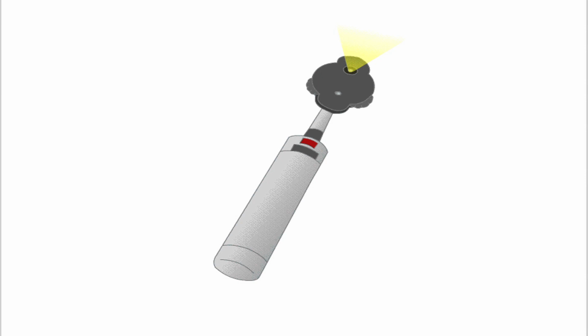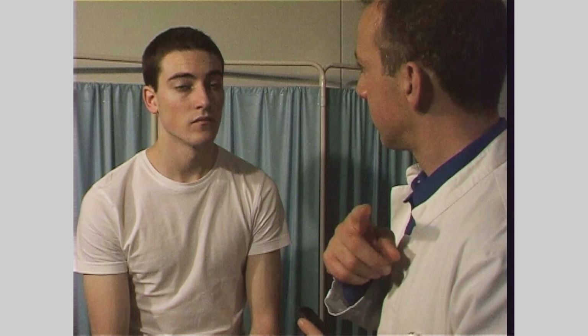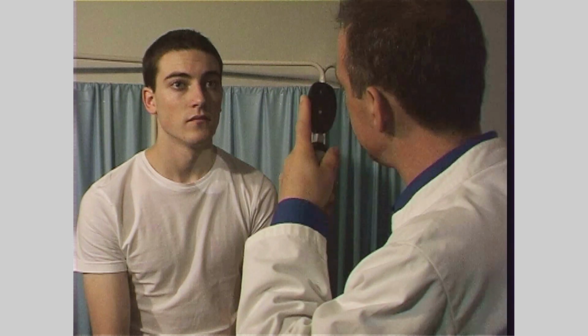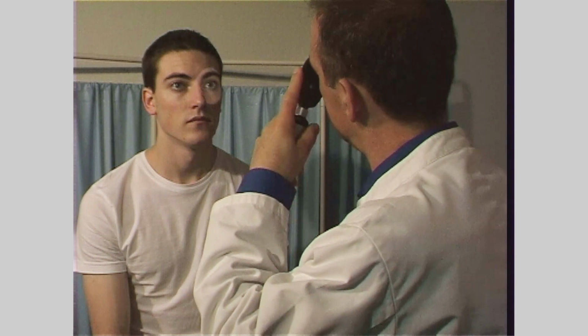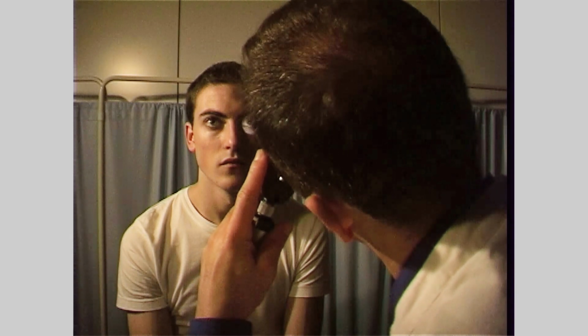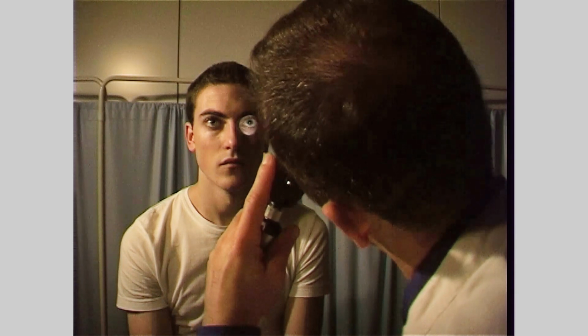Next, examine the fundi of the eyes using an ophthalmoscope. Become familiar with the instrument and know how to use it effectively. For ophthalmoscopy, you need to have the room light dimmed. First, check for the red reflex. Then look for corneal lesions and opacities such as cataracts or floaters. From about a foot away, shine the light through the eye and observe the red-pink appearance of the pupil.